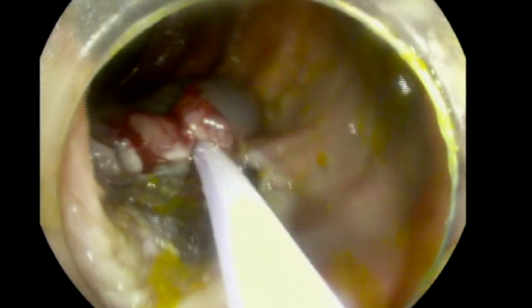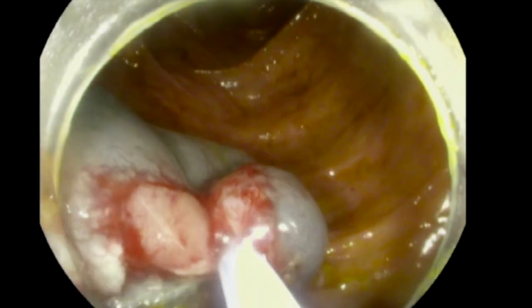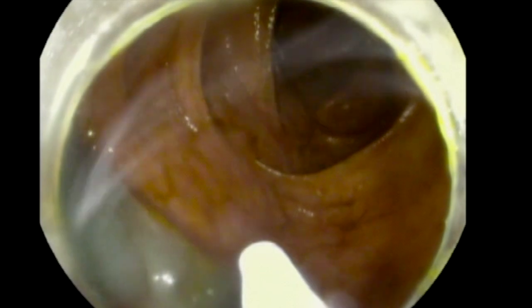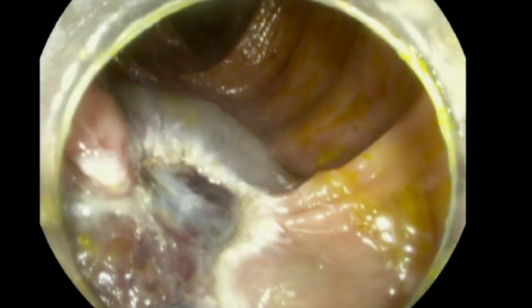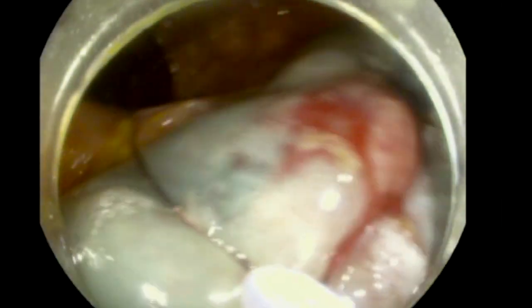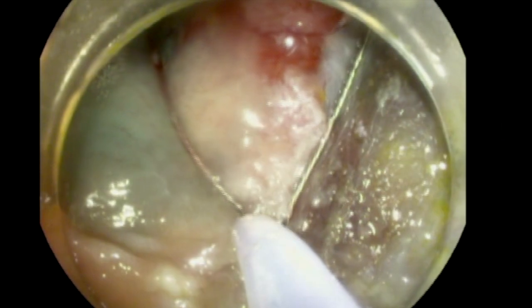Occasionally you may need a smaller snare, maybe a one-centimeter snare, to remove residual polypoid lesion. However, because we raised the lesion with this novel agent very well and have a good mucosal cushion, you can use that cushion of normal tissue with your snare and dissect. As you can see here, we are getting as much from the backside as we can and are able to dissect this area.